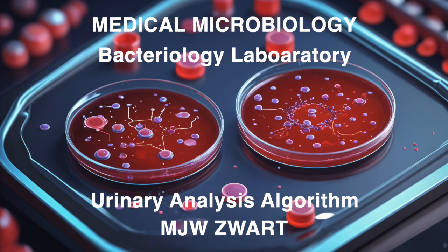Totally. Based on that Q-score, the Dutch protocol suggests a more targeted approach to culturing. If contamination is suspected, you might not need to do a full culture workup, saving time and resources. That's pretty clever. I can see how that would streamline things. But isn't there a risk of missing a true infection if you're not culturing every single sample? That's a valid concern, and the document addresses it head on.